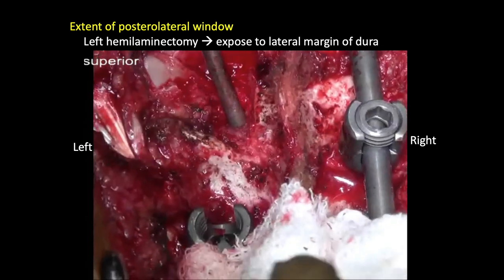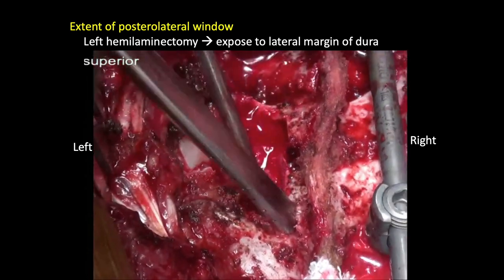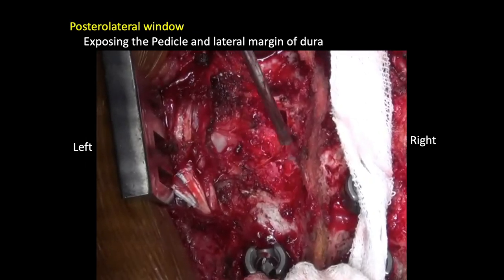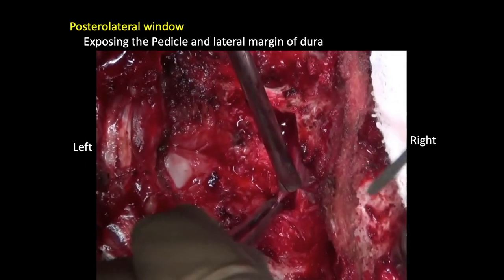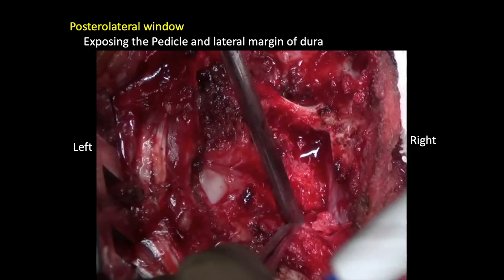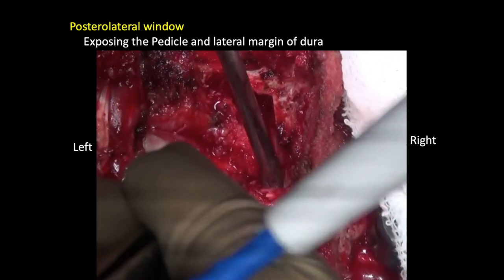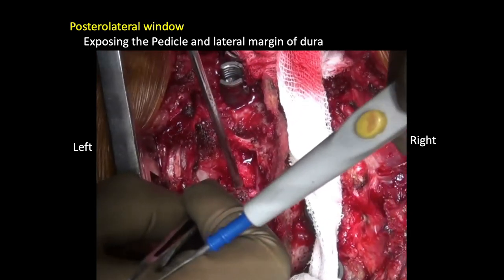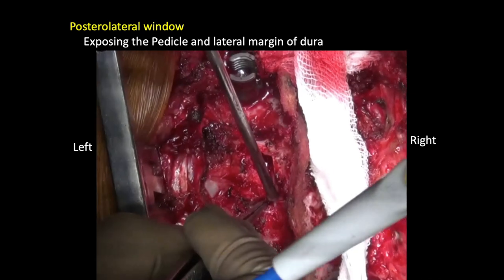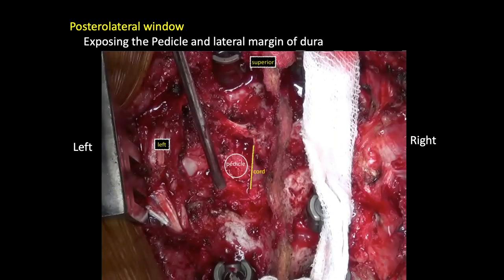I have done a left hemilamectomy to expose the lateral margin of the dura and the cord. That's the pedicle which has been exposed. The lateral margin of the dura is demarcated, and the superior and inferior nerve root windows are opened up so that I can isolate and ligate these nerve roots. That's the pedicle, that's the cord — the lateral extent of the cord. I know where my lateral extent of the cord is and I would not venture medially or retract the cord too far medially.